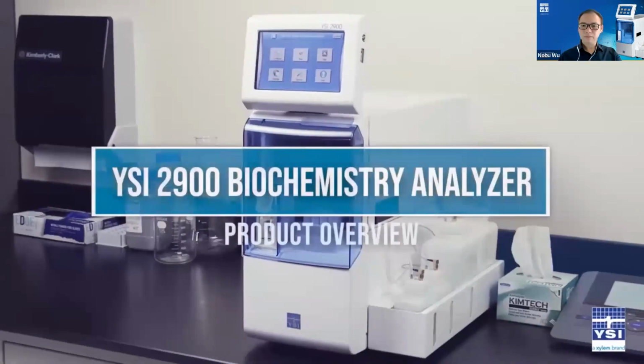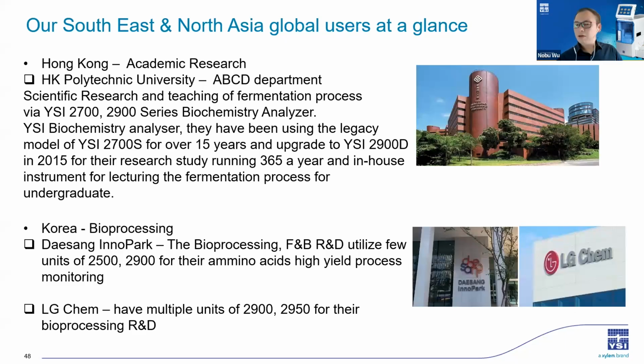Okay, so I think everyone has an idea how the YSI 2500 or 2900 are actually working. Before that, I also need to tell you the YSI 2500 and 2900 from the outlook are 100% identical. When you're really operating, you will find the user menu interface is slightly different. And the 2950 is, you can think about it, the expanded 2900 with an additional compartment next to it.